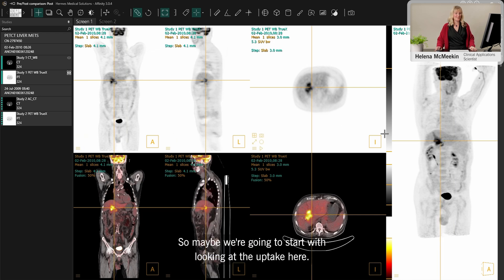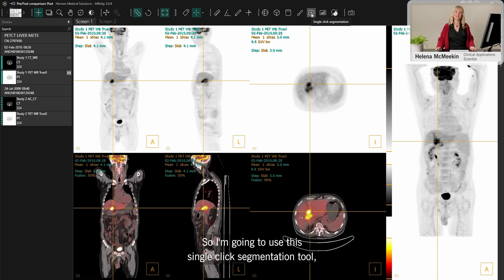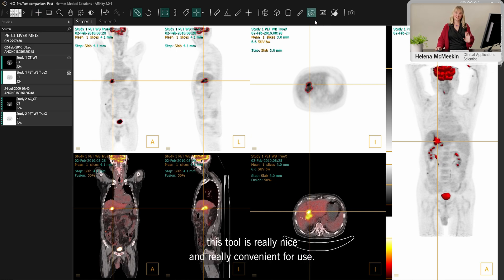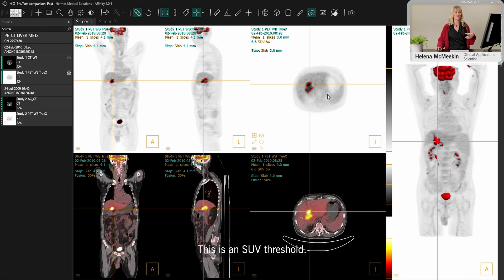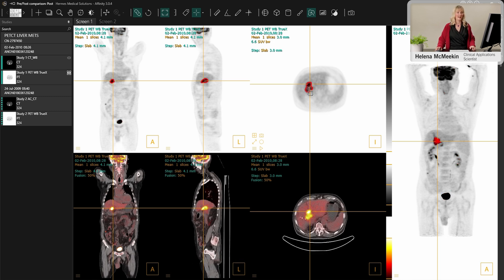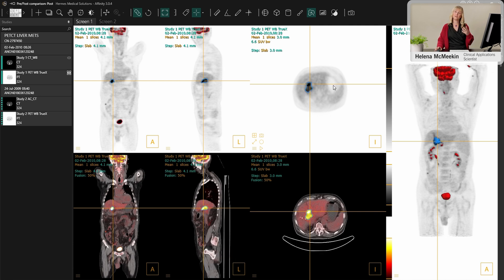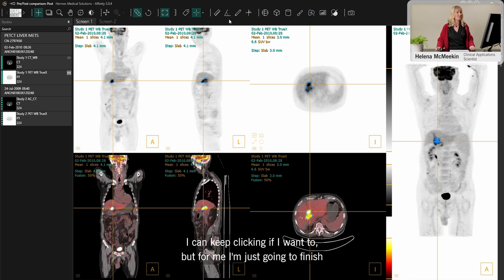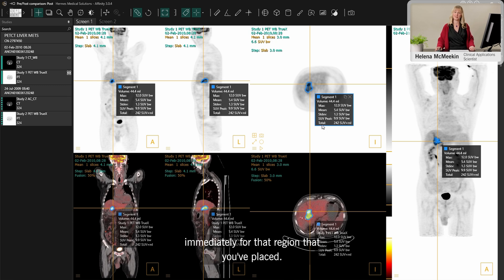We're going to start by looking at the uptake, using the single-click segmentation tool. We have a flashing preview of all the possible regions I could click — this is an SUV threshold going through the entire scan; I have four as the threshold, but you can change that. I mouse over the region to see the preview, make a click to place it, and immediately get the SUV stats for that region.